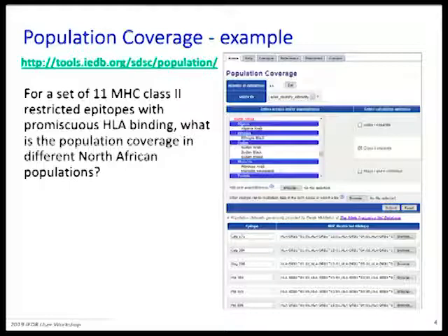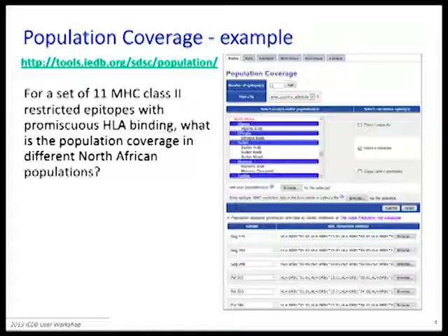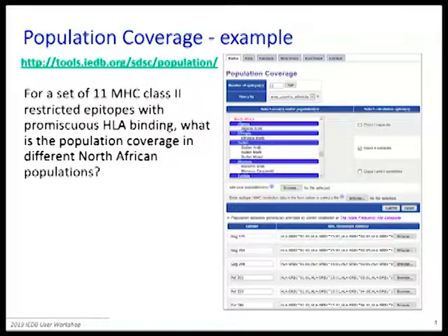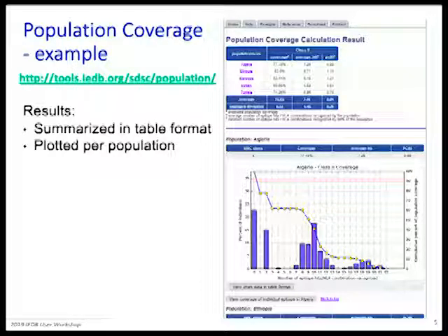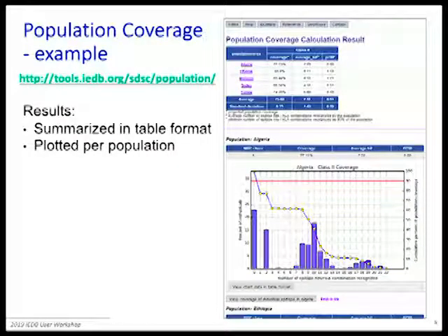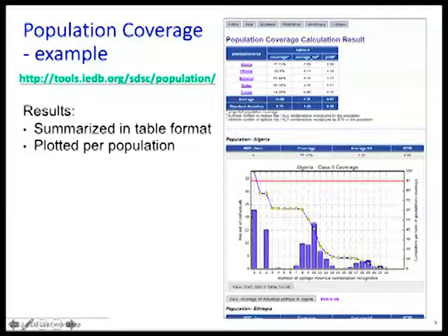In this particular example, we imagine having 11 different MHC class 2 restricted epitopes. These are promiscuous binders in the sense that they might bind multiple HLA types, but that's not always the case — the tool works regardless. After you enter your data, which is the list of reactivity of each epitope for the different HLA types, this is the output you receive.